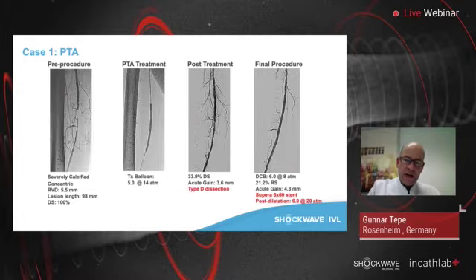If we would leave that lesion like it is here, of course, a restenosis or even early re-occlusion would occur. So in that case, a standard Supera stent was applied. This was a good result with the stent, but at least with this short but calcified lesion, we did not succeed in proceeding only with a balloon and not using a stent. So this was case number 1, and if we could have case number 2.